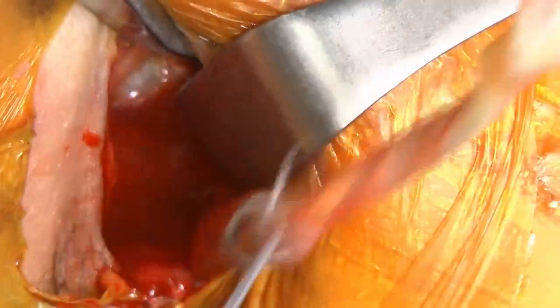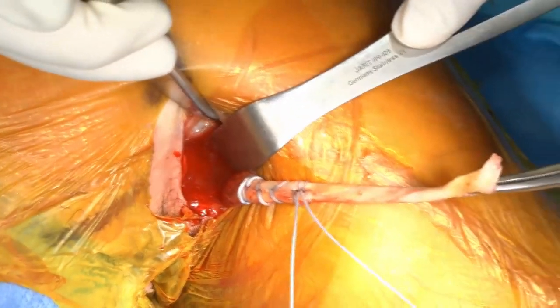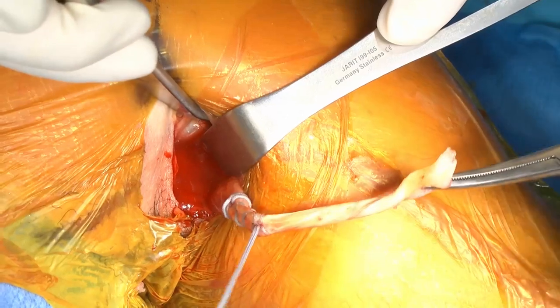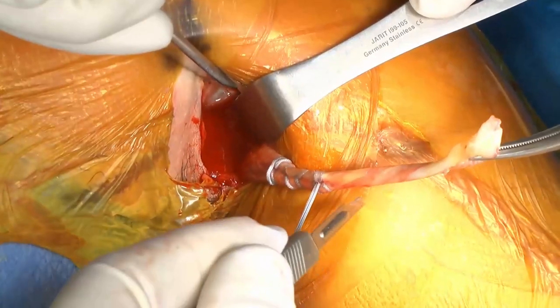All right, we'll take a knife. Go ahead and cut this for me, Chris, right here. Just cut that fiber wire. Thank you. And put the needle down, careful. And then hand me the knife back. And hold this up here. Hand me the knife, thank you. Great.